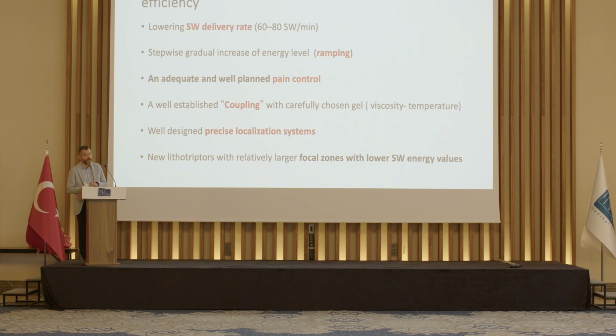So we need to take good care of the technical details. It's really important in order to have a successful procedure. We should also train our team. The shockwave delivery rate is important, power ramping is important, pain control during the procedure is important. If your patient is moving when you apply shockwave lithotripsy, then of course you're not going to focus the stone and it will be an unsuccessful procedure. Also, a well-designed and precise localization system for the stones is important. And also, the focal zones and the shockwave energy values should be adjusted based on the procedure.